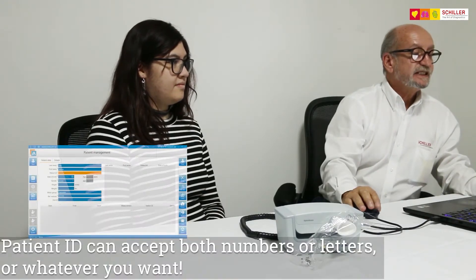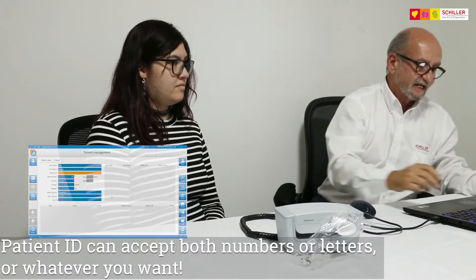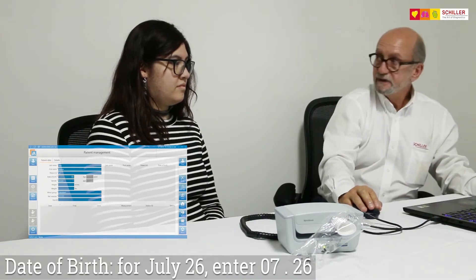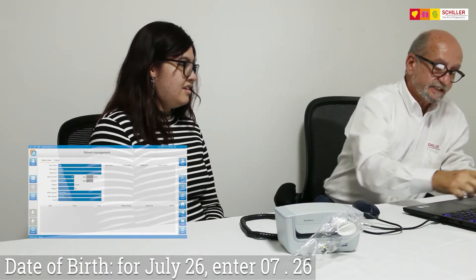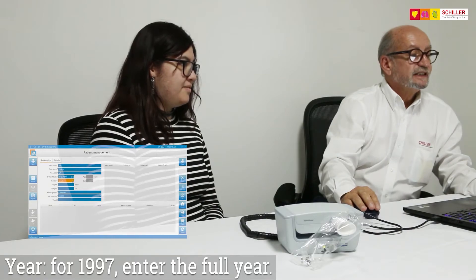Patient ID can accept both numbers or letters or whatever you want to put in. Date of birth: 07/26/1997. Just put gender: female.